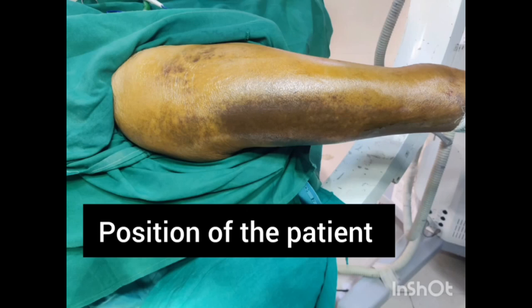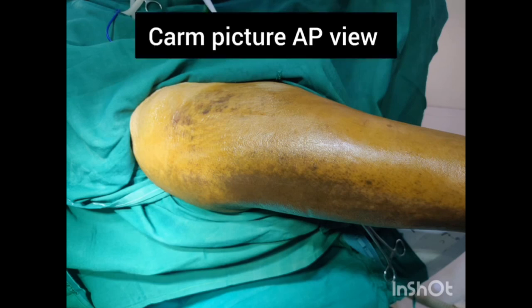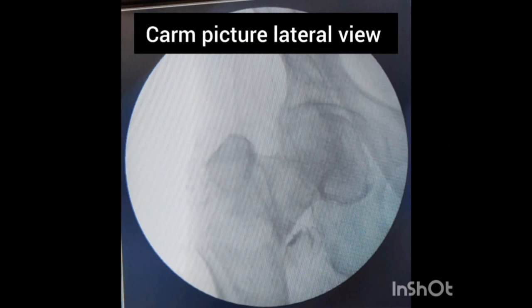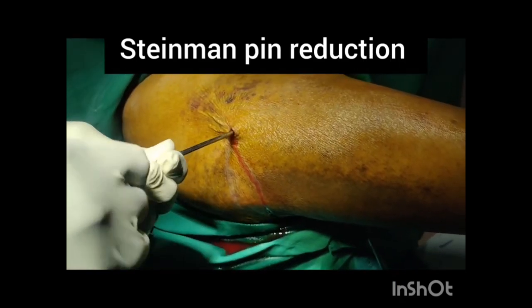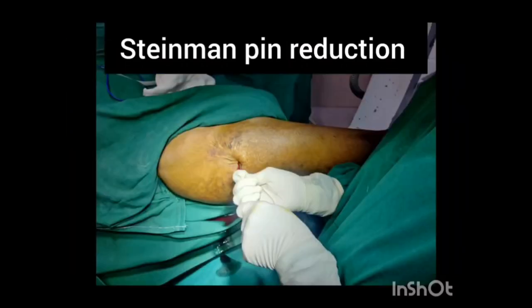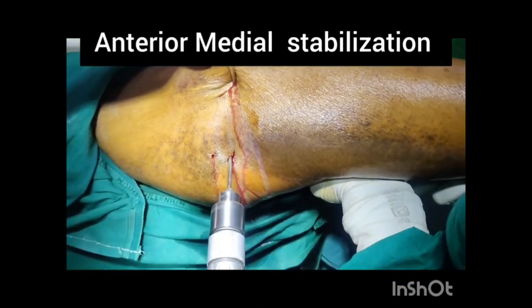This is the position of the patient on the fracture table. We check the fracture reduction under C-arm in both AP and lateral views. In this case, you can appreciate some varus in the AP view, and in the lateral view there is a posterior sag and anterior translation of the head-neck fragment. The Steinman pin reduction method is very useful here: you place the Steinman pin at the fracture site and manipulate the anterior and lateral fragment to achieve proper anteromedial reduction.